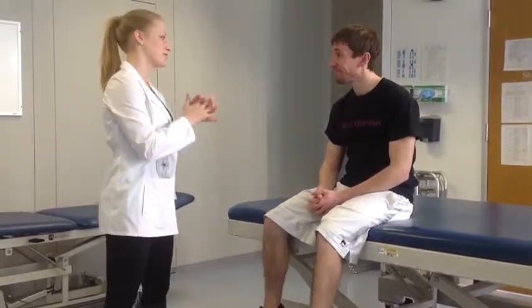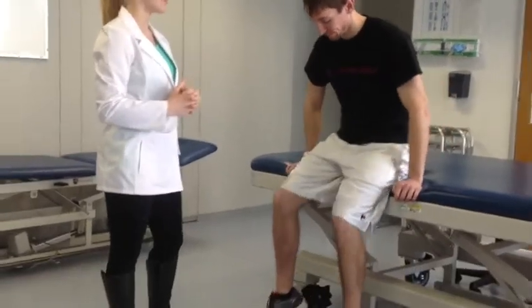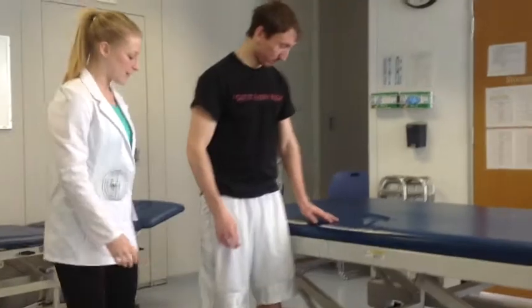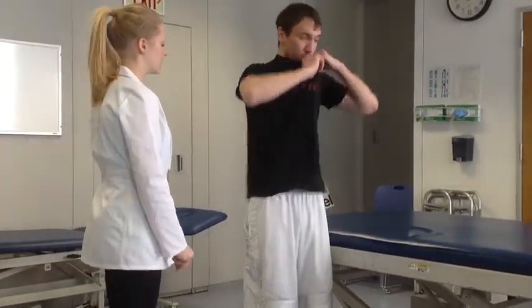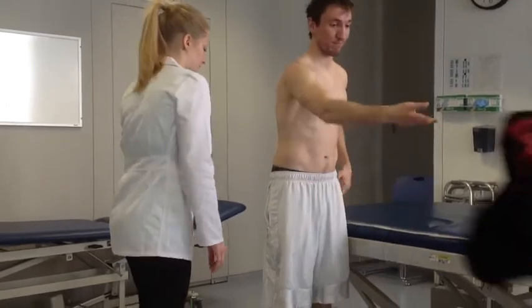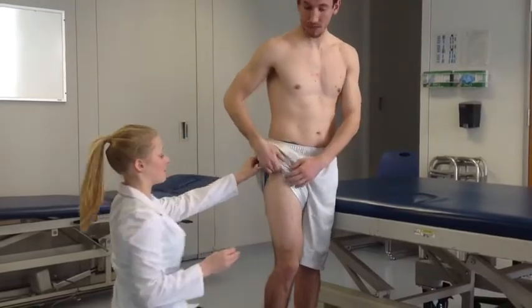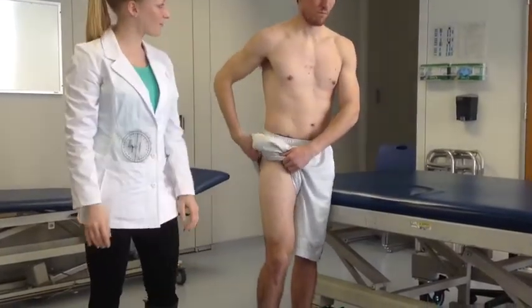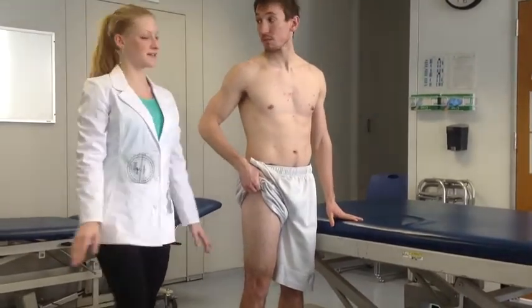Now we're going to measure some of the range at your hip joint. I'm going to measure active range of motion first, and then passive range of motion after. Can you stand up next to the table and use it for support? I'm going to have you take off your shirt so I can see your hip bones, and I'll lift your shorts like this. What I'm going to have you do is raise your hip up towards your chest like this.